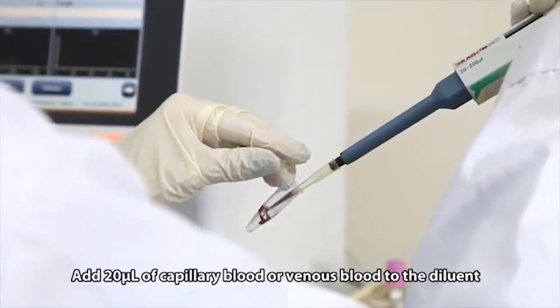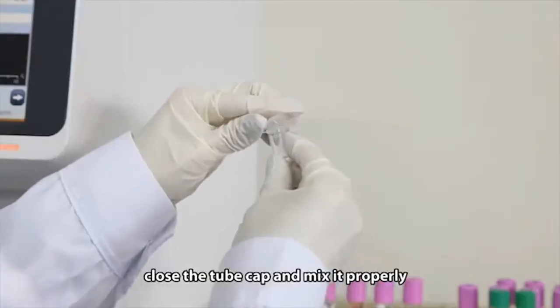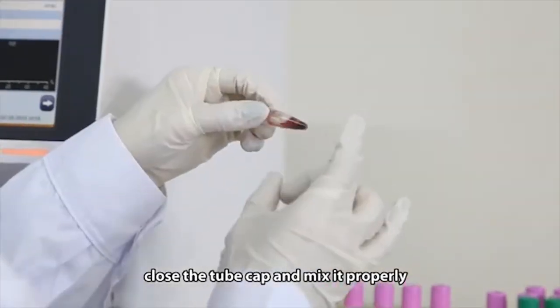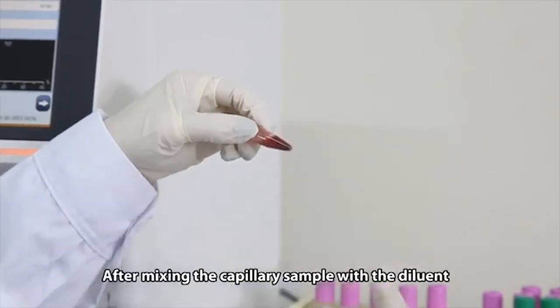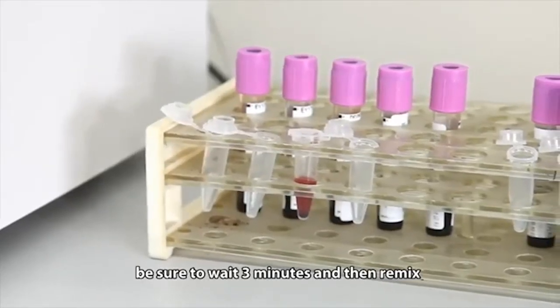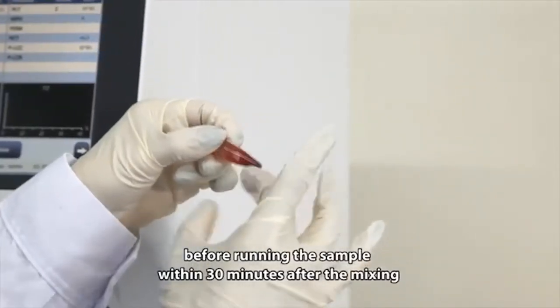Add 20 microliters of capillary blood or venous blood to the diluent. Close the tube cap and mix it properly. After mixing the capillary sample with the diluent, be sure to wait 3 minutes and remix it before running the pre-diluted sample within 30 minutes after the mixing.